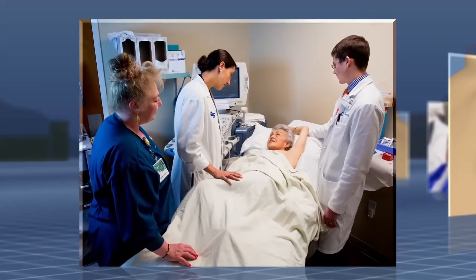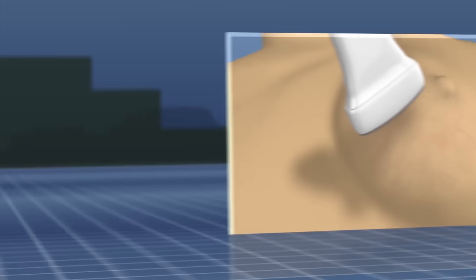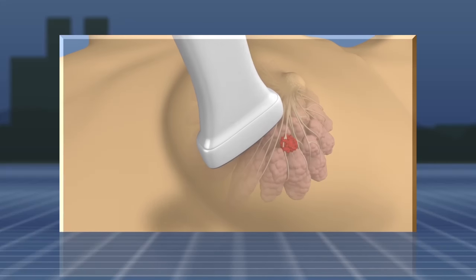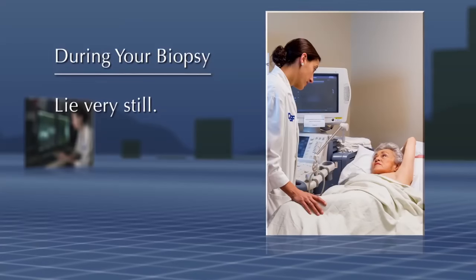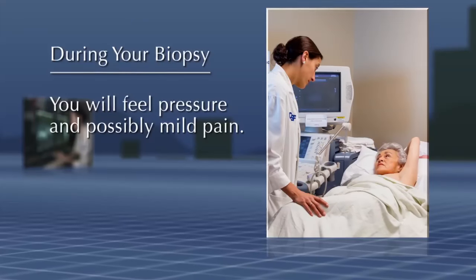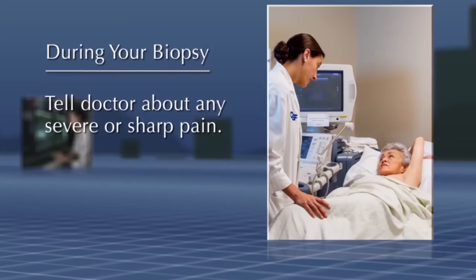Before the procedure, you will be helped to find a comfortable position. Using the ultrasound, your radiologist will identify the target area in the breast. It is important that you lie very still during the procedure. You will feel pressure and possibly mild pain. If you feel severe or sharp pain at any time, let your doctor know.